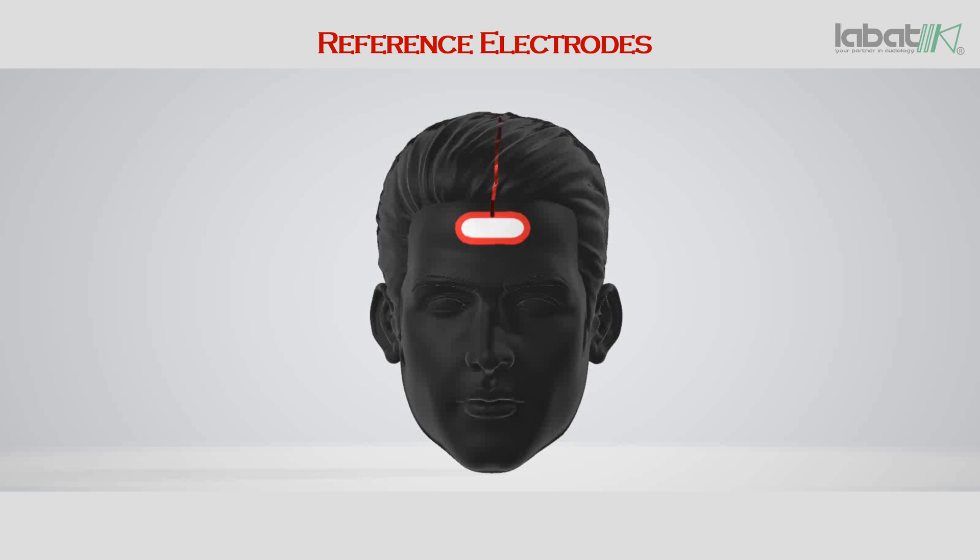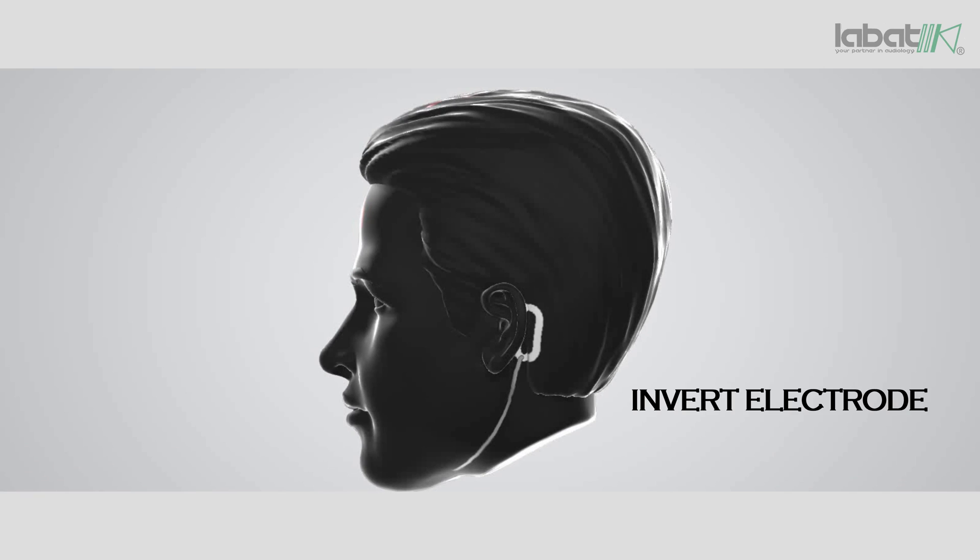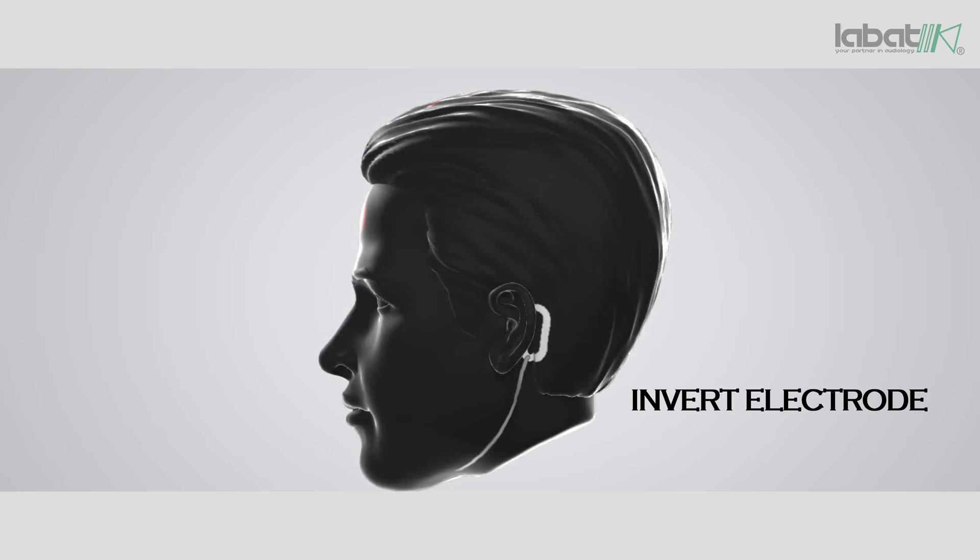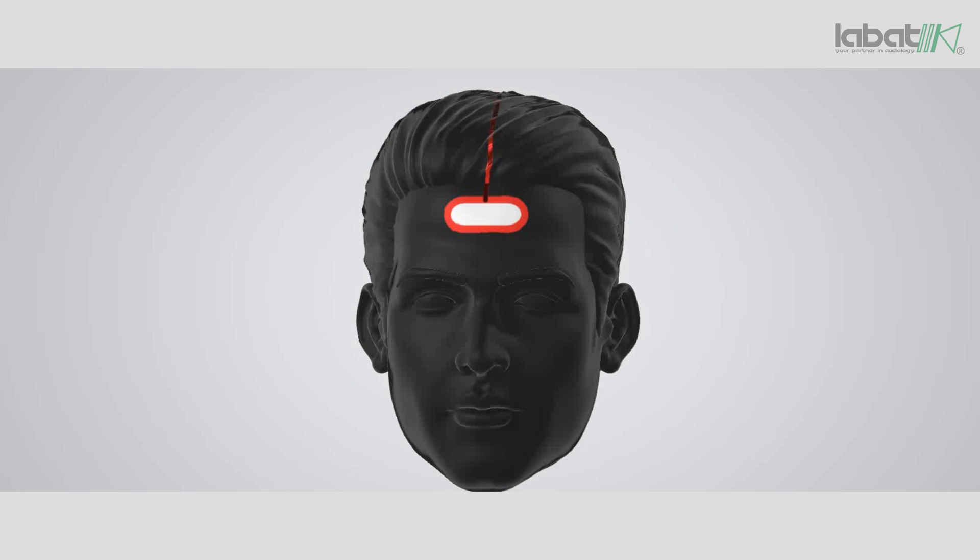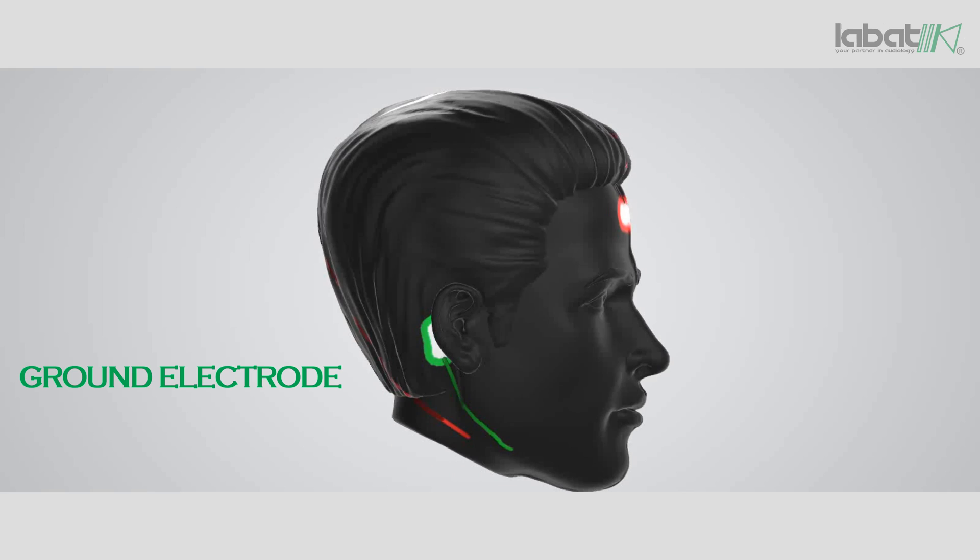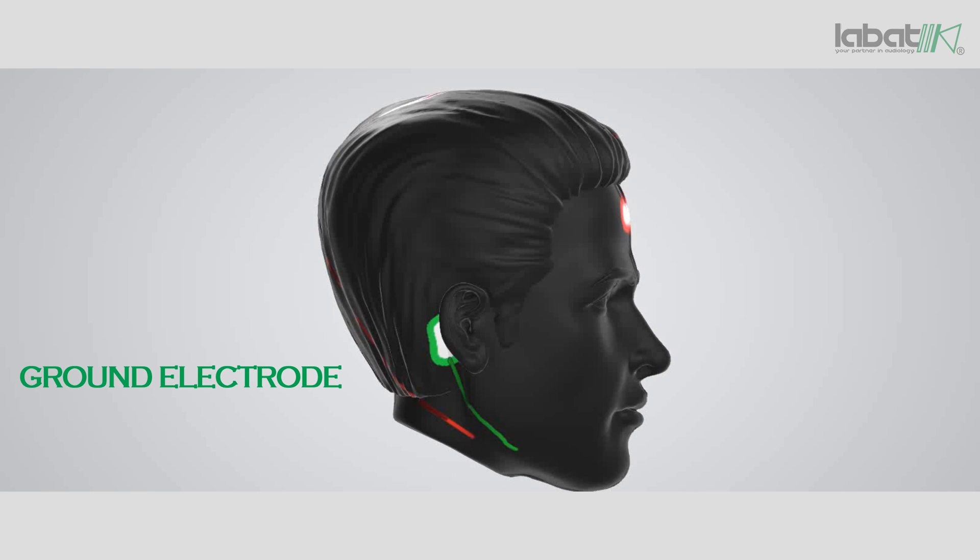Place reference electrode on upper forehead. Place invert electrode on test ear mastoid bone. Place ground electrode on non-test ear mastoid bone.